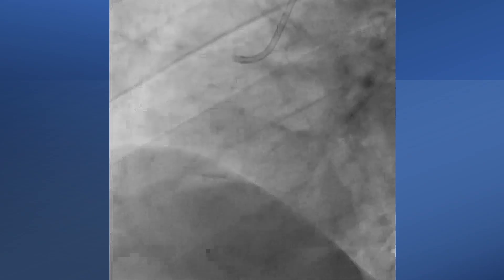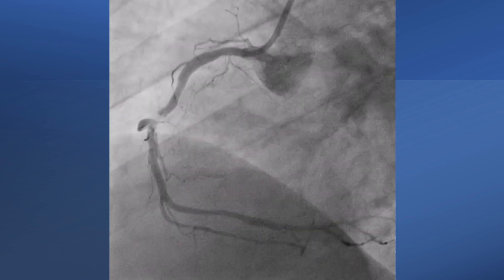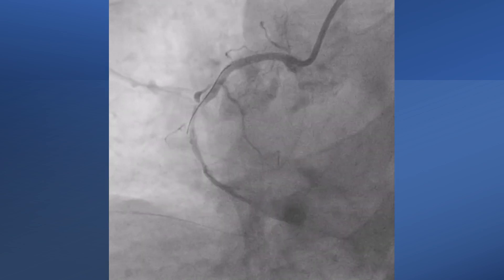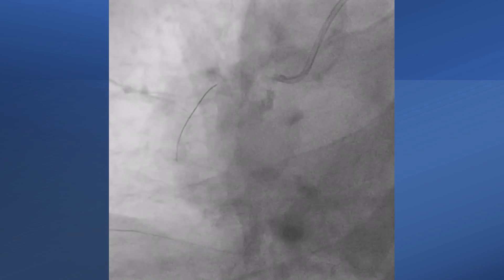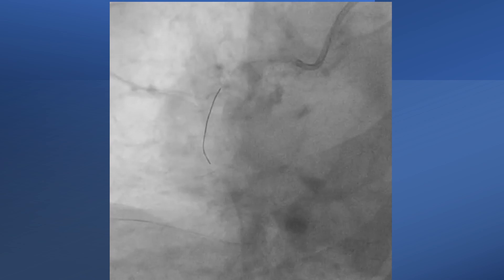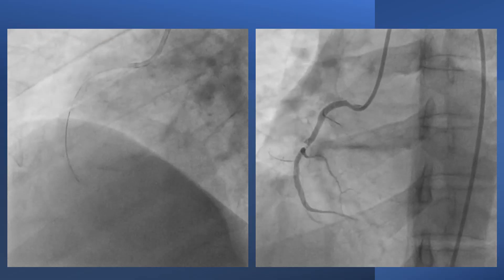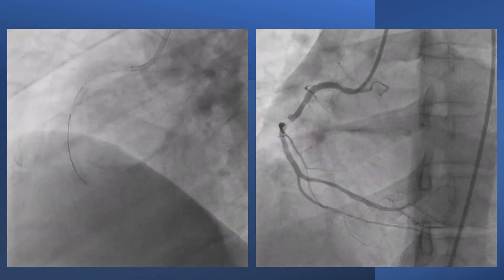The reason why I made this presentation is because I observed that plaque disruption by PCI wire is not well recognized and simple cases are turned into nightmares. Look at this beautiful RCA with a subtotal occlusion and some plaque ulceration. It was clear from the beginning that the wire was going into the plaque and dissecting its way. Yet, the operator kept pushing hard. And finally, this beautiful artery was lost, maybe forever.